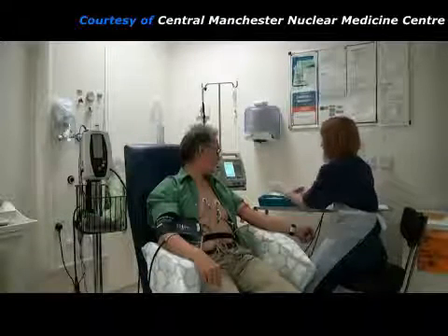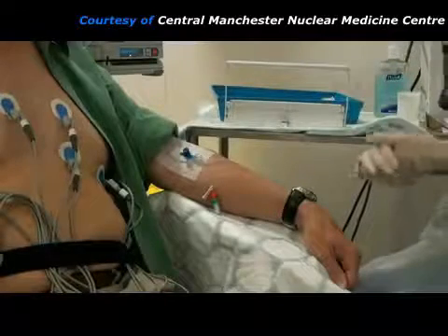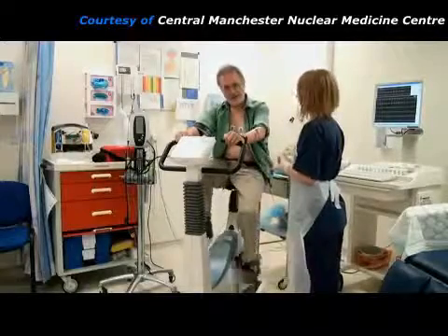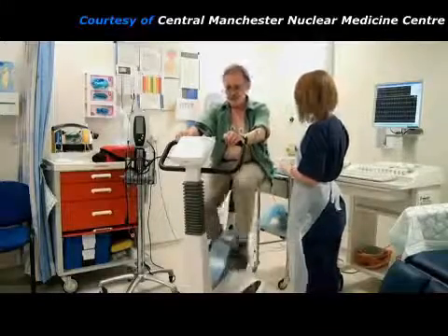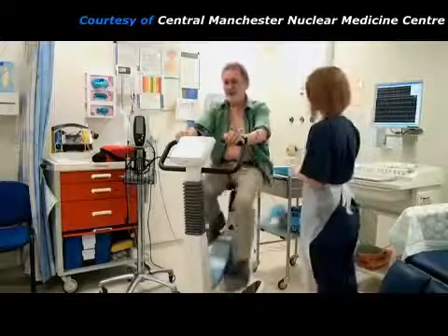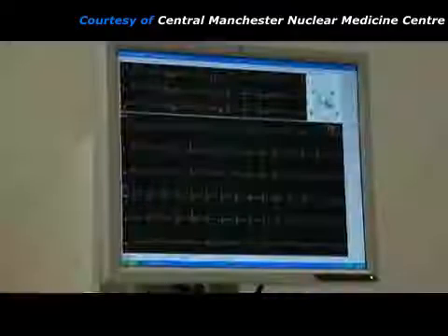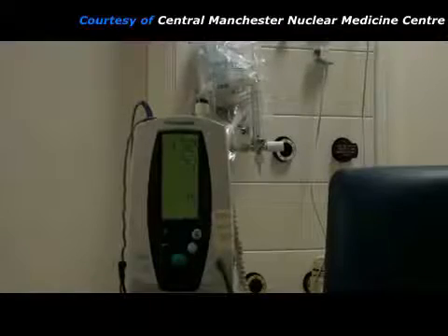The practitioner inserts a needle into a suitable arm vein, which will make it easy to give injections later. If the patient is capable, they can sit on an exercise bicycle and begin pedaling. This exercise will increase their heart rate. The resistance of the bicycle is gradually stepped up so that the patient has to pedal harder, which increases their heart rate further. The practitioner checks whether the patient is experiencing any symptoms and encourages them to keep going, monitoring the patient's heart using the ECG machine and keeping an eye on their blood pressure.